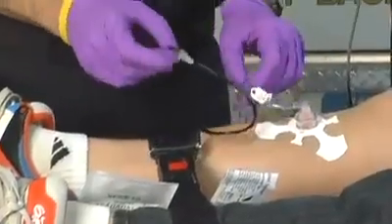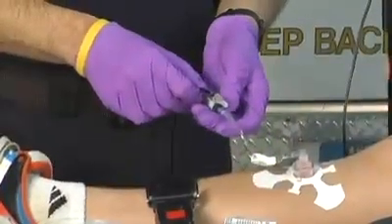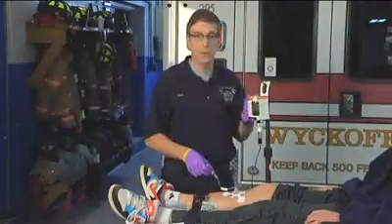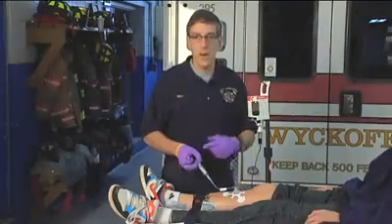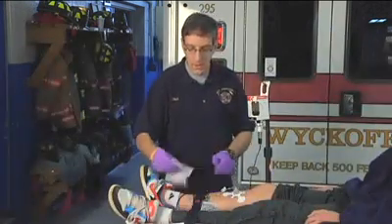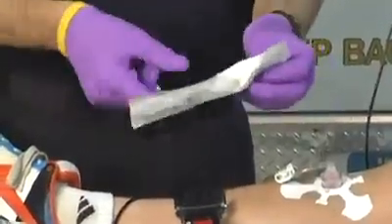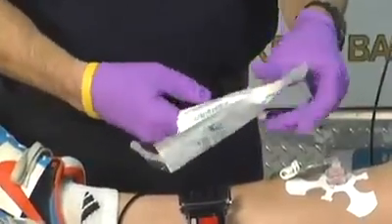If we were to connect this bottle to the intraosseous line, we would not be able to squeeze the bottle to get the medication to move into the patient any faster because it's a glass bottle. So we've already flushed the intraosseous line with a power flush of 10 cc's to clear some of the debris inside of the bone cavity. We'll take the stopcock — which we carry with the Cyanokit as an added supply, not something that comes with the kit itself — and connect it to a 30 cc syringe.